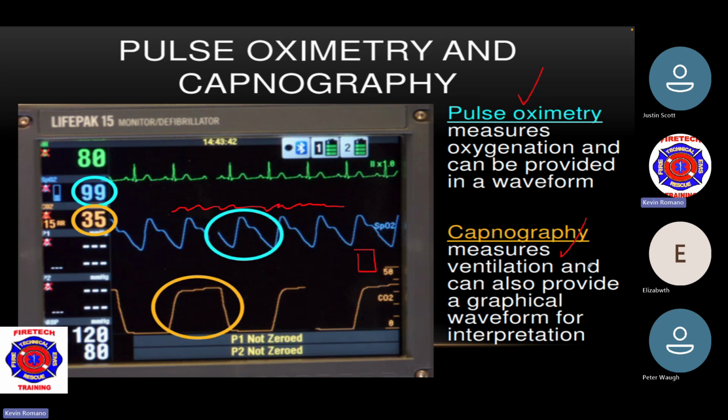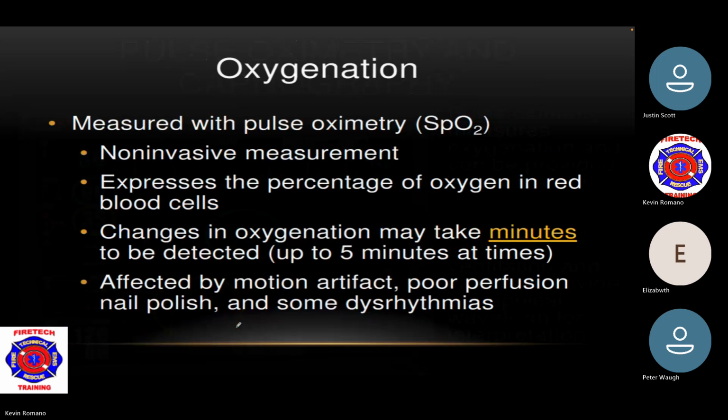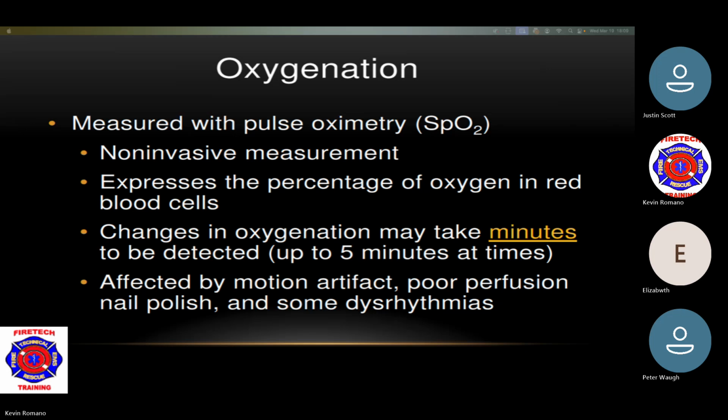And as always, I speak to the national standard. So you should know your state protocols, what you can and can't do, but I'm going to cover the national standard, what can be administered for this. All right, so we're going to look at that waveform. We're going to go more in depth on the waveform here and how this inhalation, exhalation phase actually works. I do have the chat box open if anybody wants to ask a question through the chat box as well. I can try to answer those as we move forward.